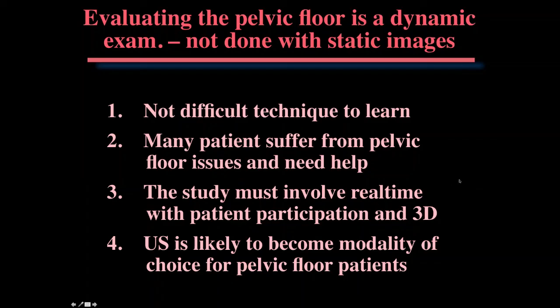So the cystocele Valsalva clip showed some debris in the bladder. Is that a common finding with incomplete voiding? No, I haven't seen that many patients because we're really sort of starting to do this. But I think it probably is because these patients tend to have urinary tract infections. And if they're not able to void all the way, some debris is just going to remain there and probably result in some urinary tract infections.